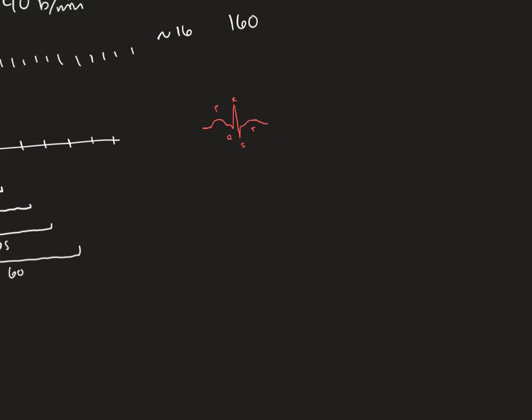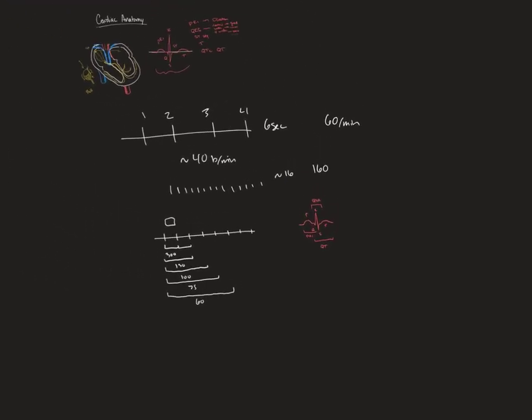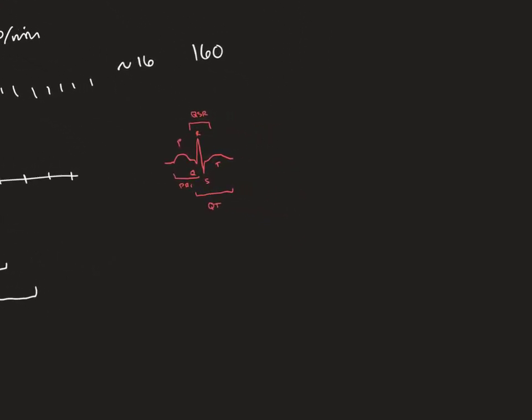And we'll highlight our PR. We'll highlight the important bits, and then just the P wave and just the T wave. So the P wave is supposed to be small and rounded. It's typically a positive deflection, and that's coming from sinoatrial and atrial depolarization, which the notes will go over, like dipole, repole, the electrical gradient, the chemical gradient, all that stuff. I'm not going to go over that verbatim because that's annoying.